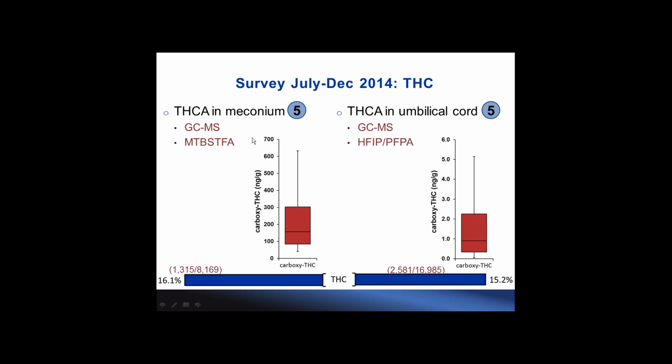concentration distribution charts. What it shows is that there is a middle line in the distribution chart. That means a median concentration. In other words, half of the population is below this concentration and the other half is above.